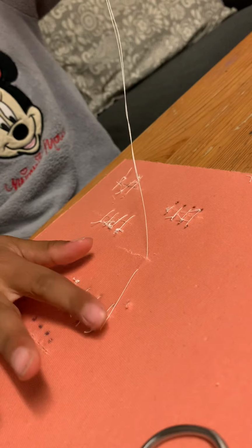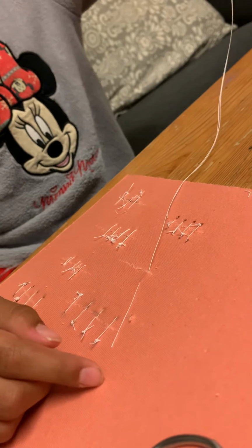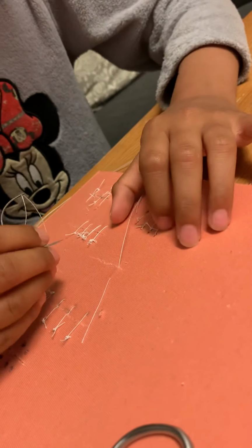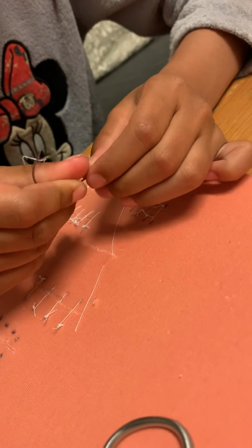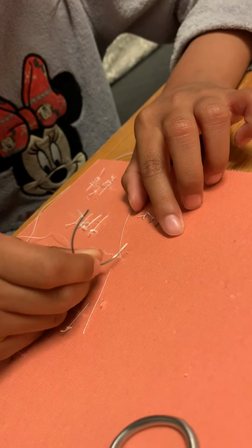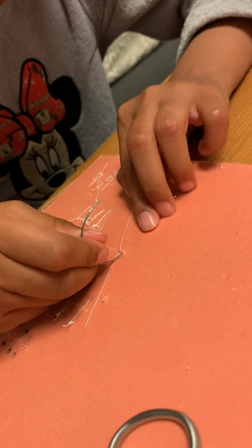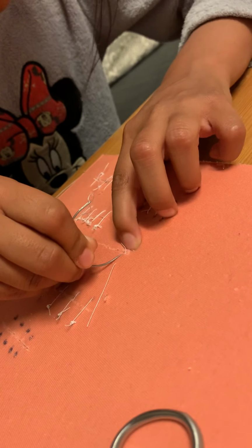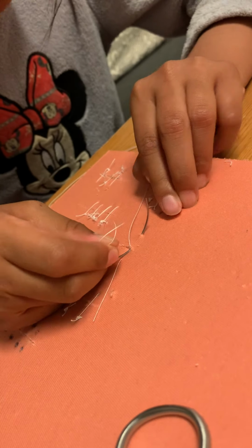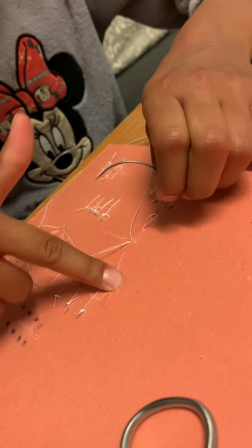And we can make it a bit big, because while we're doing the third to last step, it could get a bit unloopy and you could ruin the whole stitch. So stay tuned to see that bit. And so the next step is to make it easier. If you're confident, you could try it without opening the wound, but the actual way is to open the wound so you actually get it inside, and then at the perfect space to take the needle out, hold this, and then you get this big loop out.